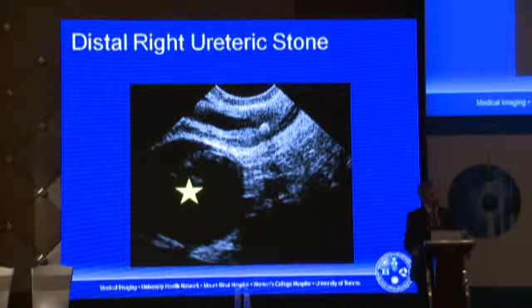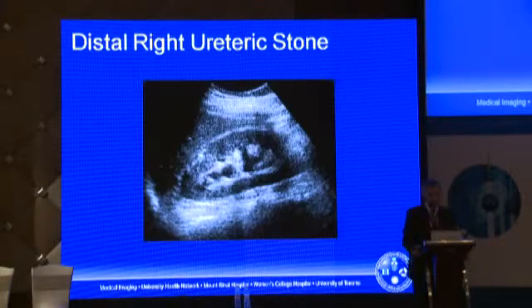There was a little bit of hydro. Remember, only a pelvic ultrasound was ordered, but I have a very low threshold to just take a quick look at that right kidney, and there was hydro, and here with the internal scan, the ureteric stone is very nicely visualized with the dilated ureter proximal to it.